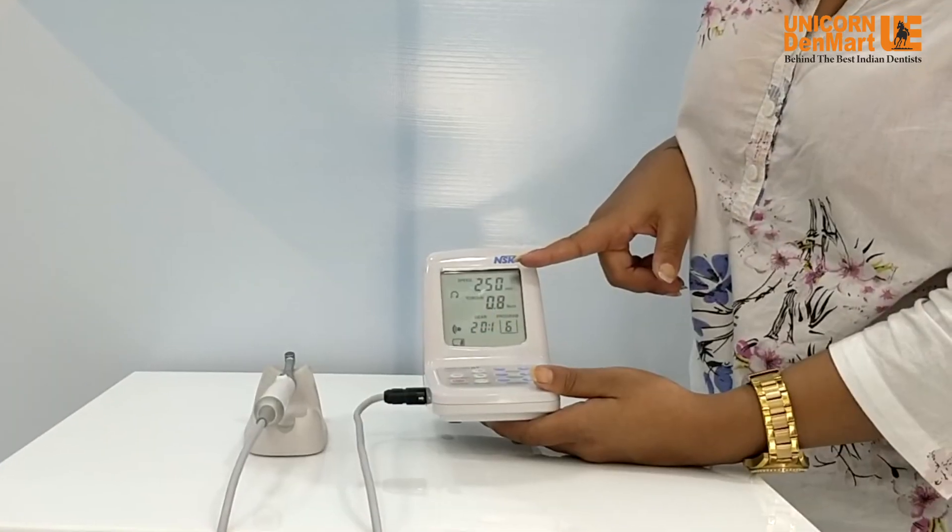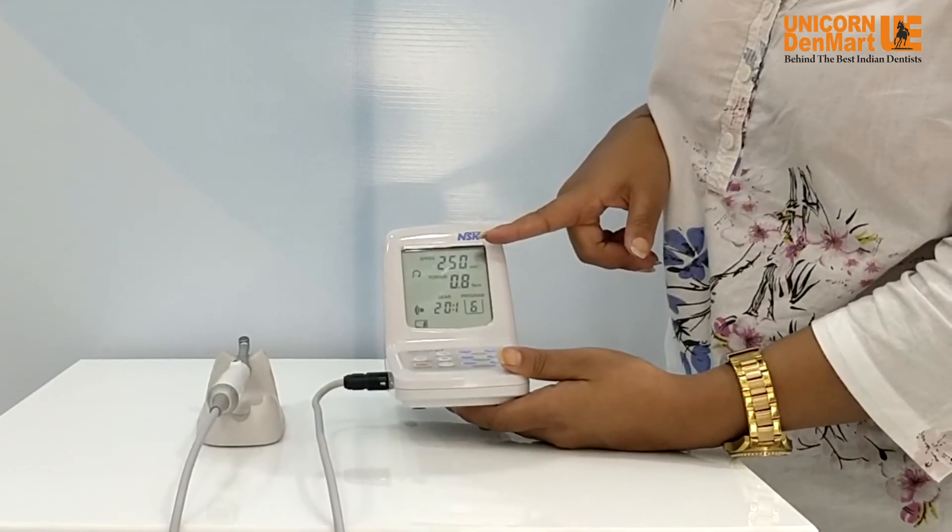As you can see, the Endomate DT from NSK Japan is easy to install and use, and will prove to be an excellent companion for any clinician.